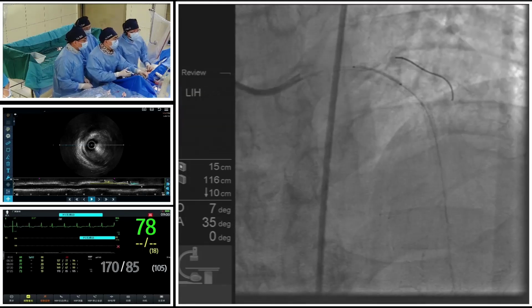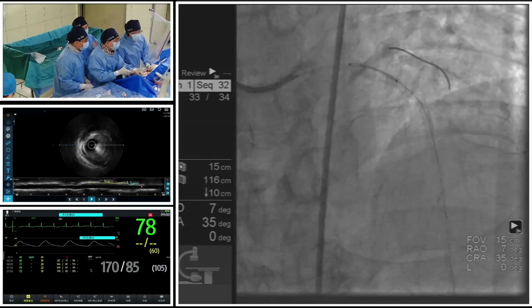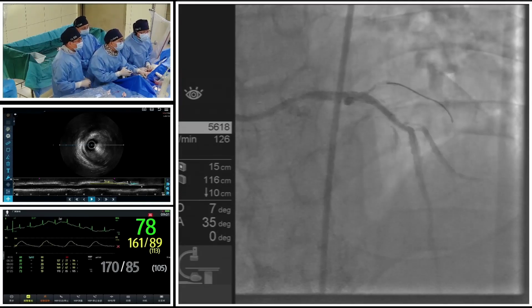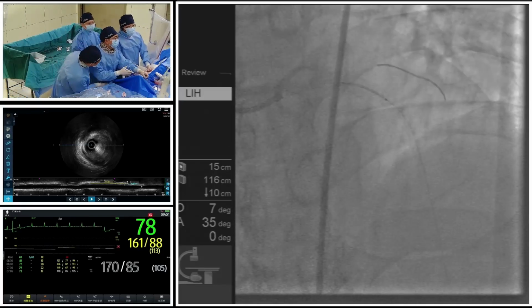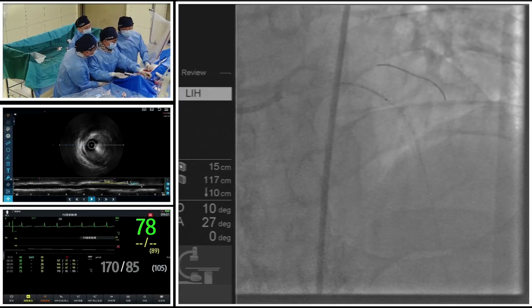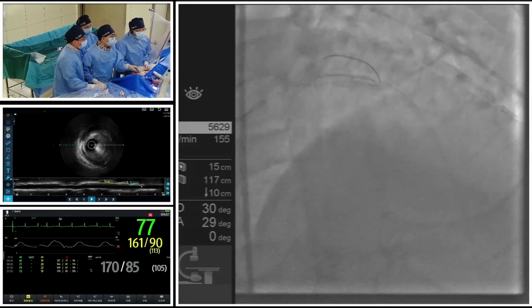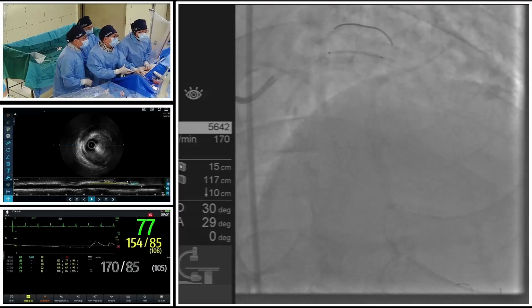This is our whole idea, a very important piece of information: always try to use a 1-to-1 ratio IVL balloon to perform the shockwave function, not, for example, as some operators try, to use a 4.0 IVL balloon to solve all the problems. I think this is not a good idea. This kind of combination usage can also reduce some potential risk compared to conventional balloon modification therapy.